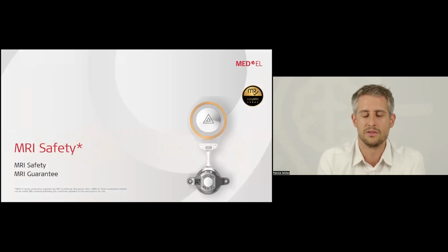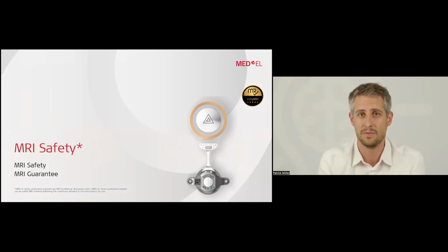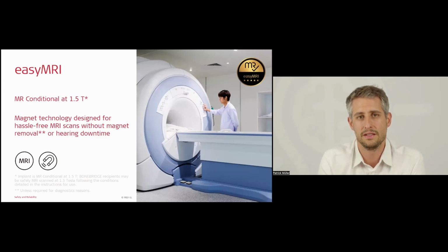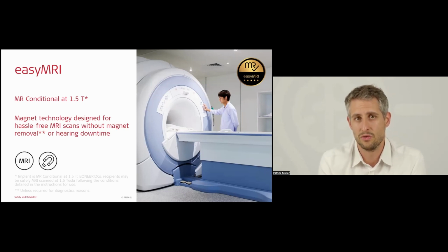Last but not least, I would quickly like to talk about MRI safety, which is not only important for bone conduction devices, but all implants from MED-EL. We have MRI safety, and we also have an MRI guarantee here. MRI safety for the Bonebridge is MRI conditional at 1.5 Tesla, meaning that we are using a very special technology which allows hassle-free MRI scans without the need of a magnet removal. And with that, there is no surgery needed before and after an MRI, and with that, there is no hearing downtime for the patient. And this is also true for our other implants.